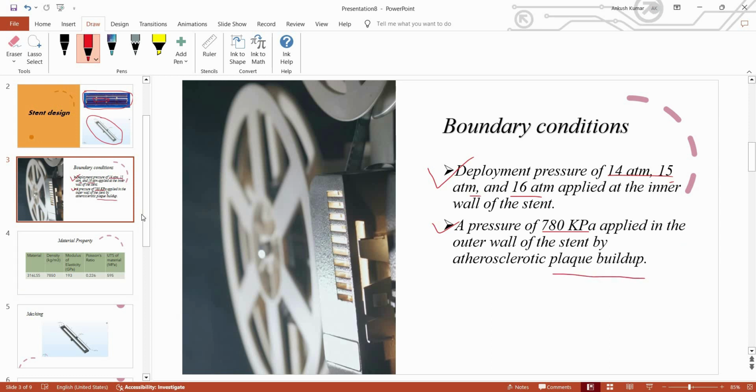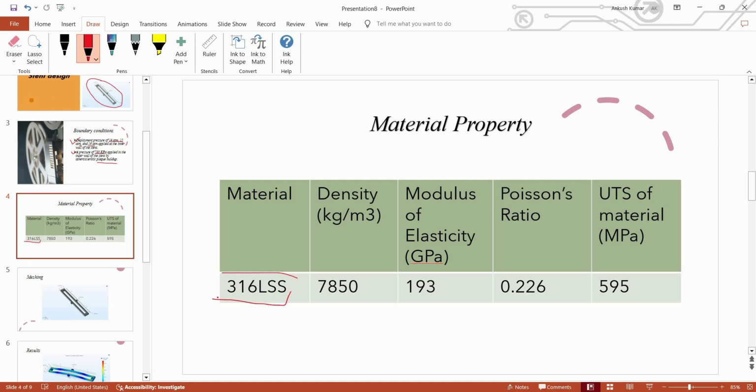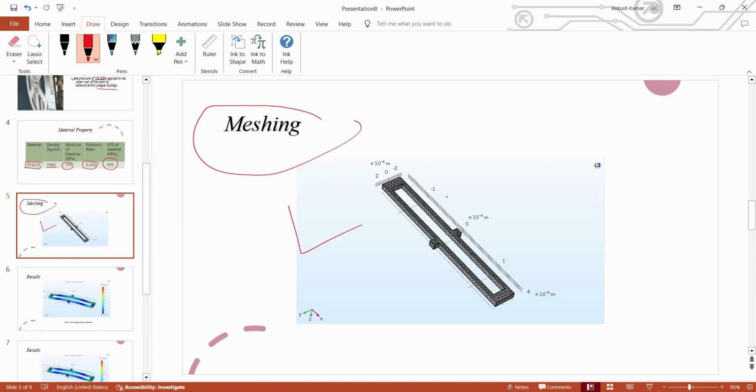And for performing the structural mechanics, we need material properties. So we are taking the material 316 LSS. The density is 7850 kilogram per meter cube, the modulus of elasticity is 193 gigapascal, and the Poisson ratio is 0.226. And this is the meshing, as you can see in the image. Meshing divides the whole structure into small elements. On the small elements, a particular equation is solved by the software. That's how we get results.